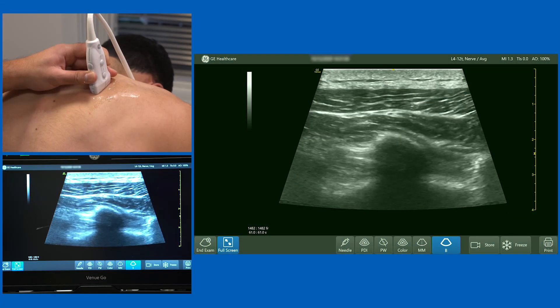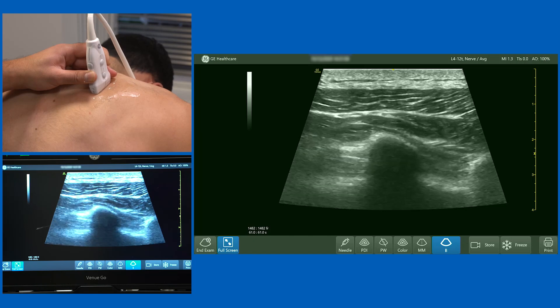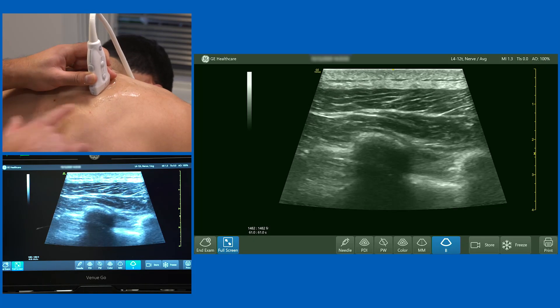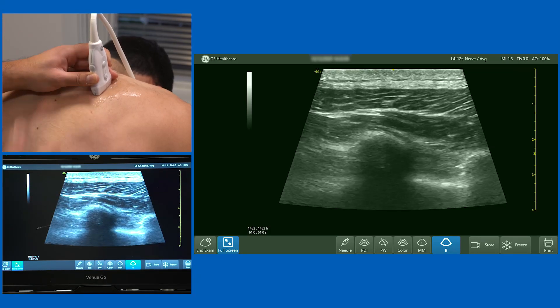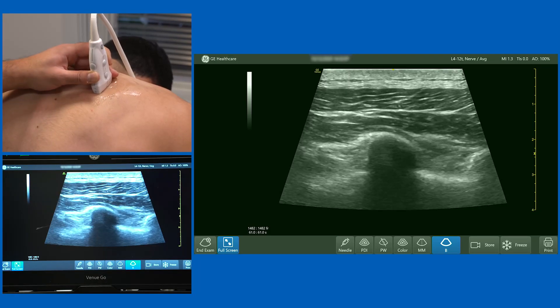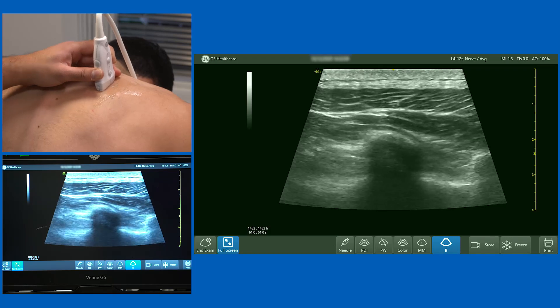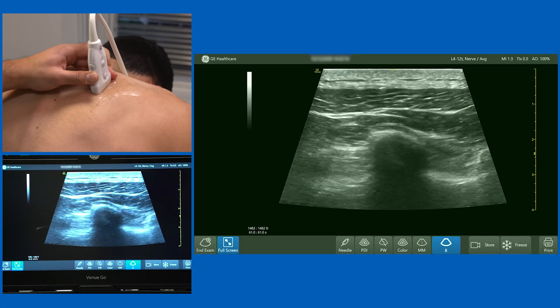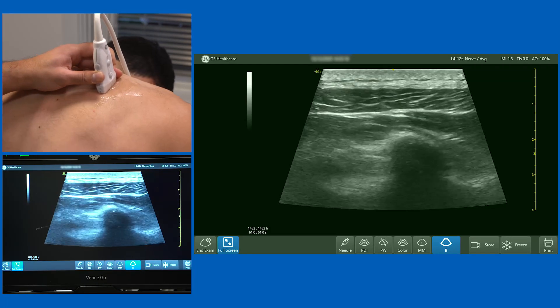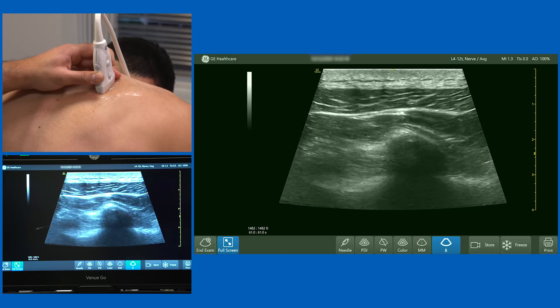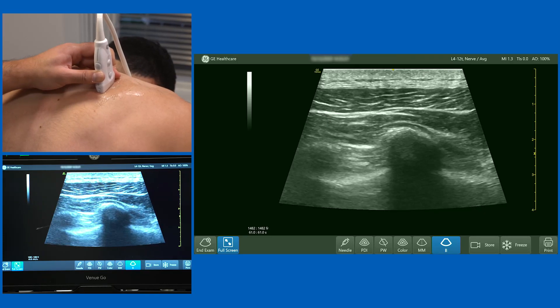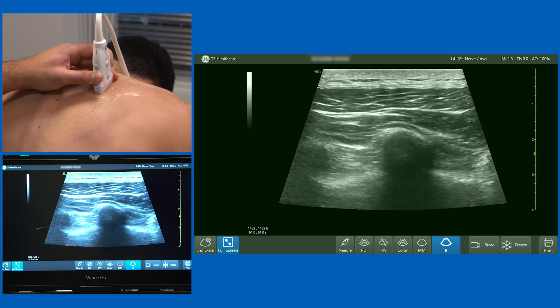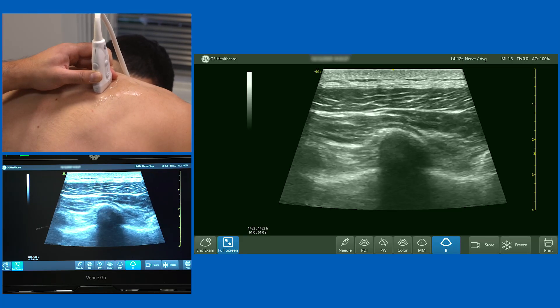We're now going to scan for the erector spinae plane block. I'm using a high frequency linear probe, placed laterally on the chest wall, taking a paramedian sagittal slice through the posterior aspect of the thorax. The left-hand side of the screen is cephalad, the right-hand side is caudad. Being far out from the midline, any bright white hyperechoic lines with a dropout artifact below them, such as the one in the centre of the screen, is likely to be a cross section of a rib.